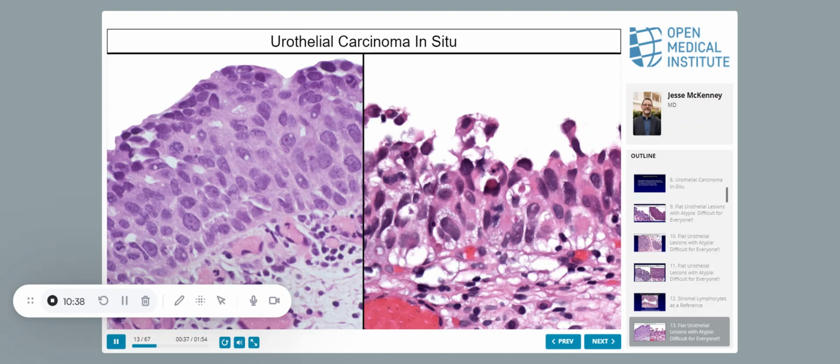You can't go on mitotic figures, but there is a mitotic figure here. And again, these are markedly enlarged with a lot of variation. So is everybody okay with carcinoma in situ for these two? No? What bothers you?